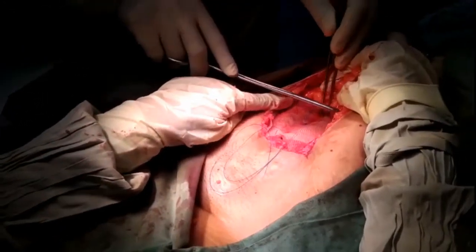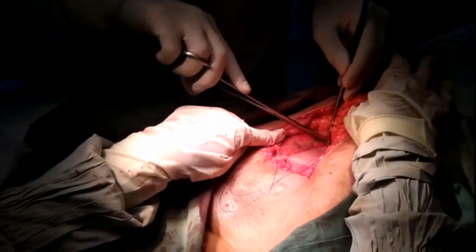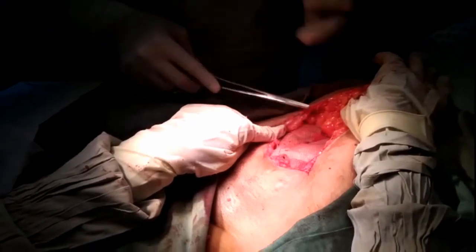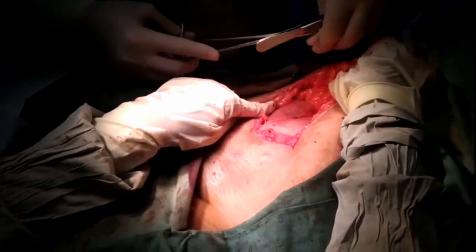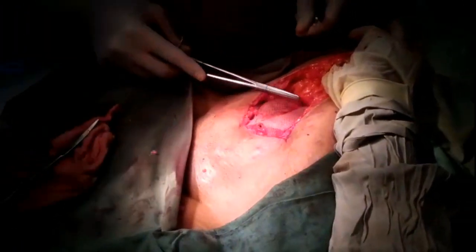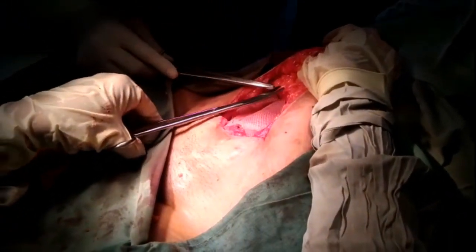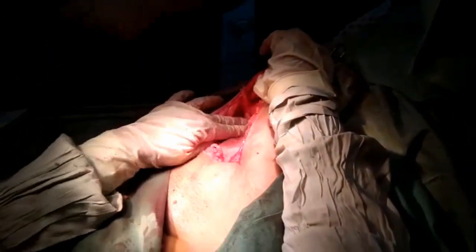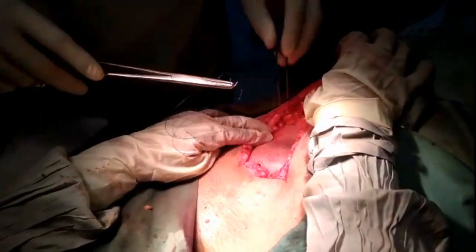If there are multiple defects and some are small, they are primarily closed. You have to repair the primary tissue for small defects. The big main defect is closed separately. Small defects around the main defect should be closed first, and then the main defect is addressed. Do not leave small defects unattended as they can weaken the repair.